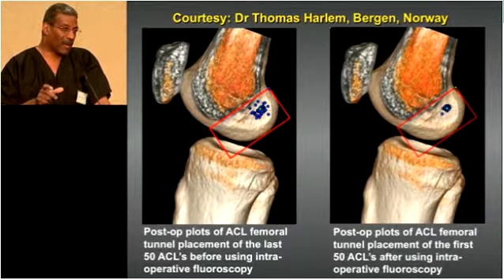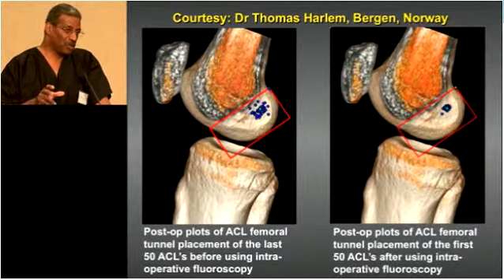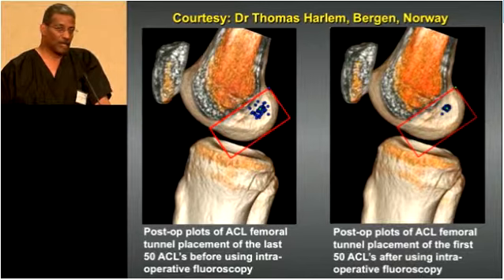How often am I off? On the tibia, 20% of the time, usually too anterior on the tibia. And I change it. It takes about 2 minutes to change it on the tibia. Any other questions?